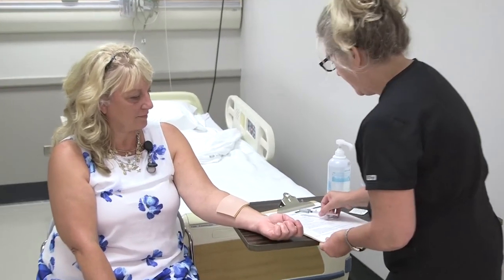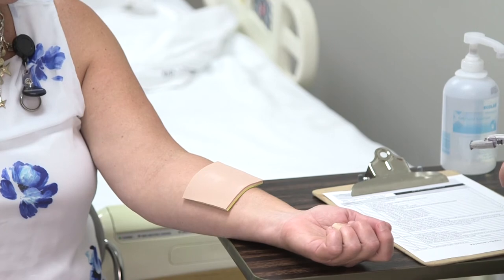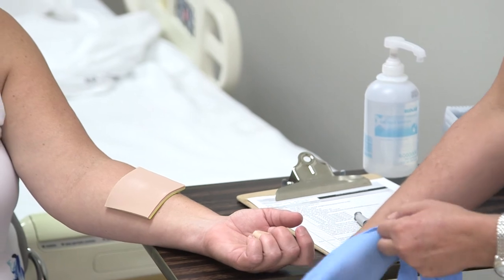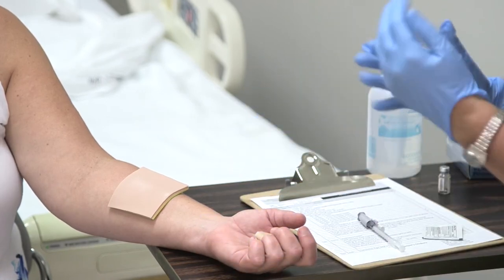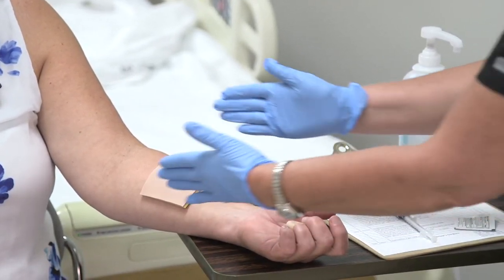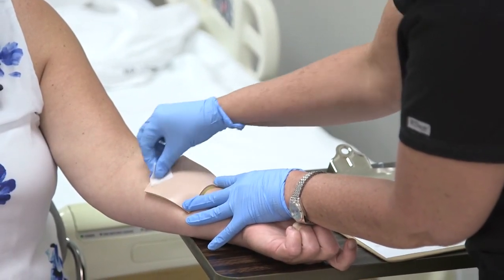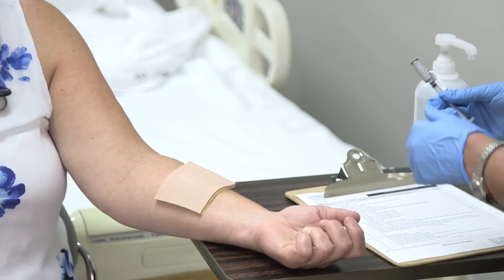I'm going to assess my site, making sure I avoid any open areas, scratches, bruises, lumps, or bumps, and ensure I have a nice clean, even site. I'll go ahead and prep the site by cleaning it with an alcohol swab, then let it dry.